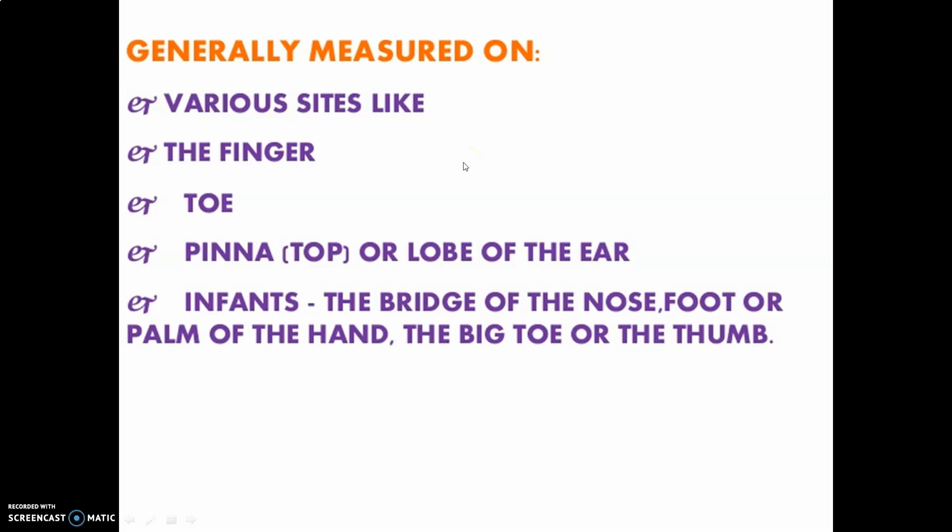It is generally measured at various sites, like the finger. Basically we keep it on the thumb. Even the toe, the great toe, you can keep it.